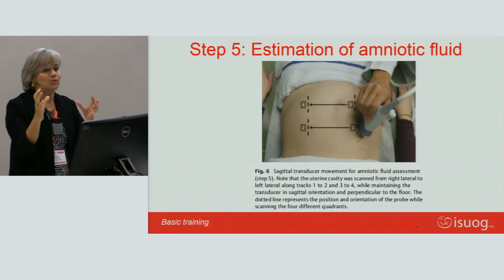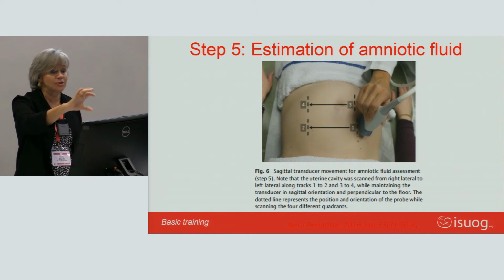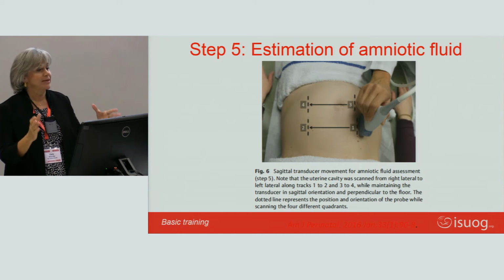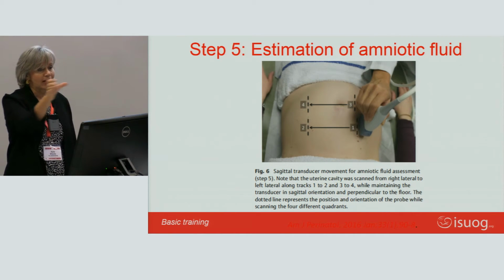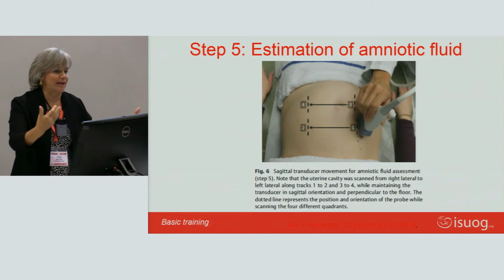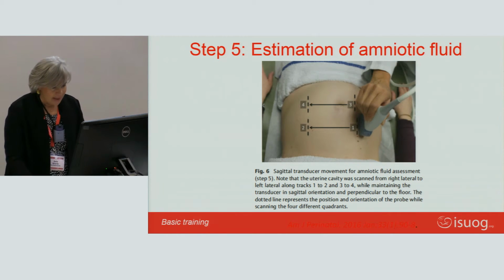In actual fact, there was one head, but by rocking his transducer, it was producing a head up and a head down. This underlines the fact that we should always use our transducer perpendicular to the floor, and only when we are more advanced can we venture into more tricks.